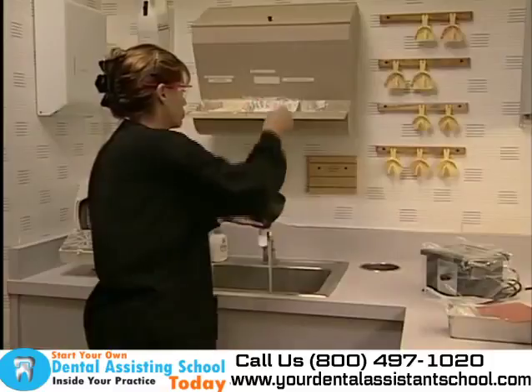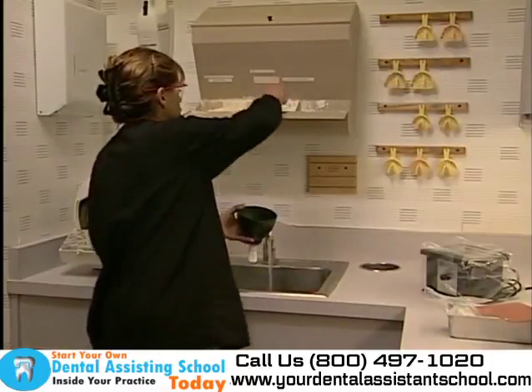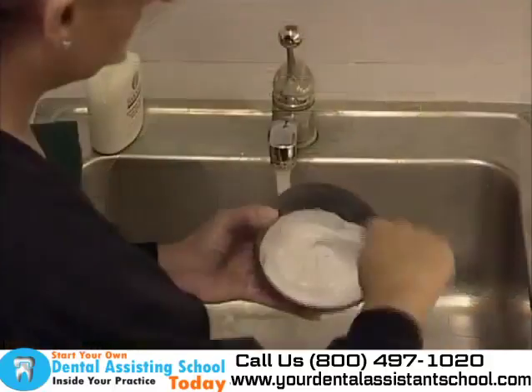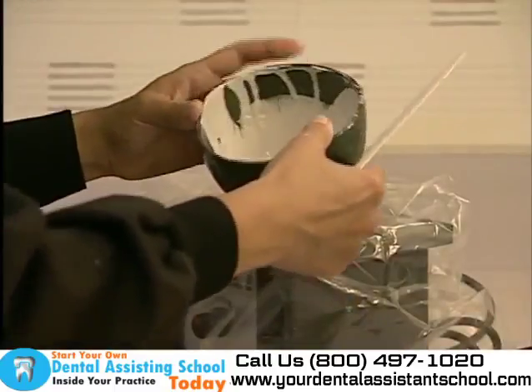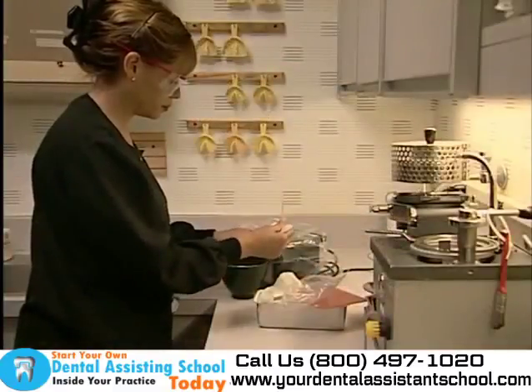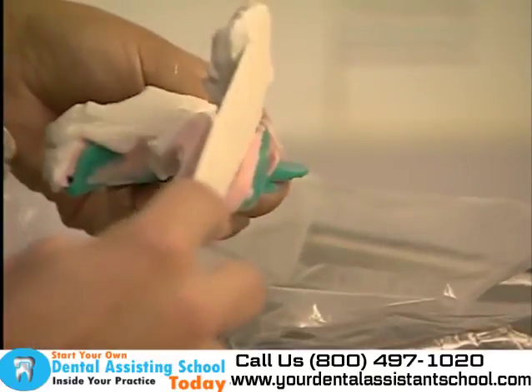The study model materials, typically gypsum, plaster, and water, are mixed together. The instructions for specific materials should be consulted. Once mixed, the gypsum is vibrated to remove trapped air bubbles caused during mixing. Small amounts of gypsum are vibrated into the impression to evenly cover all tooth surfaces.